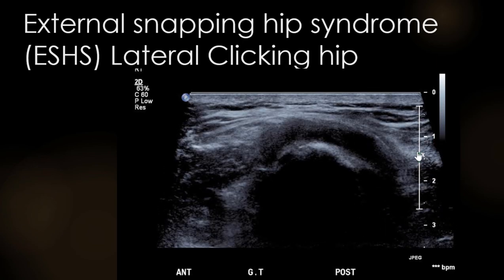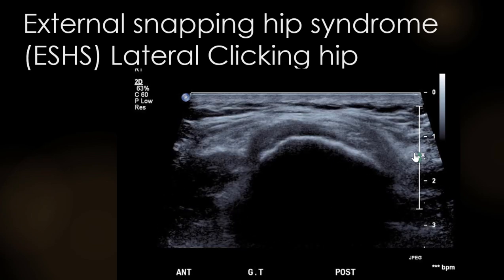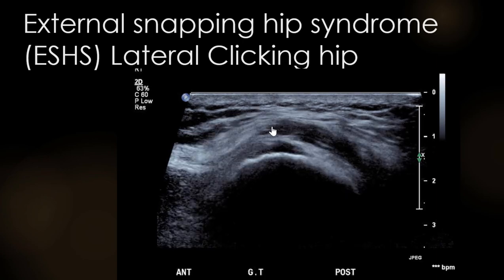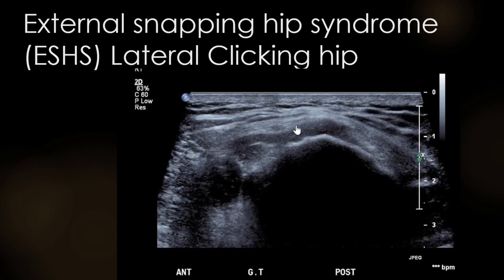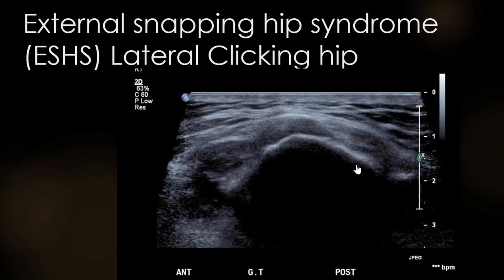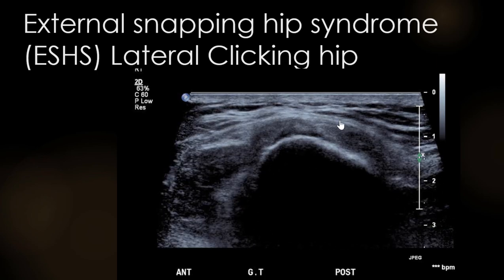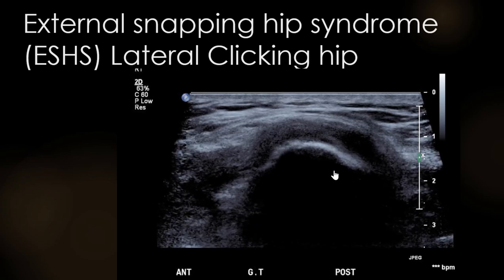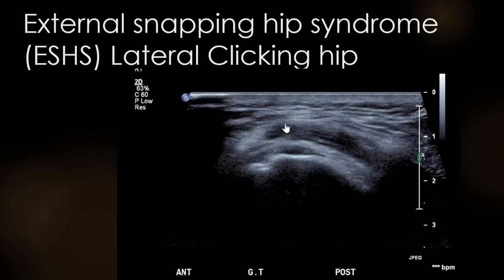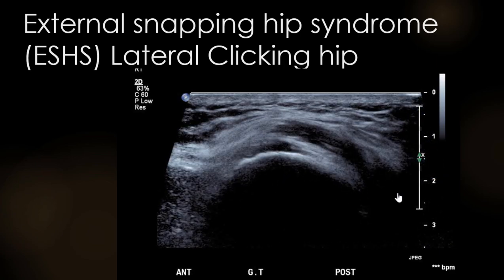If you watch glute max, there's the anterior edge of it, and you'll see it quickly snap over. So the muscular part of the maximus has now come right forward to this point. I'll let you watch TFL over here. So we see no muscle at this point, and during the movement, all of a sudden, bang, there's the muscle, and it's going to snap back off in a second.